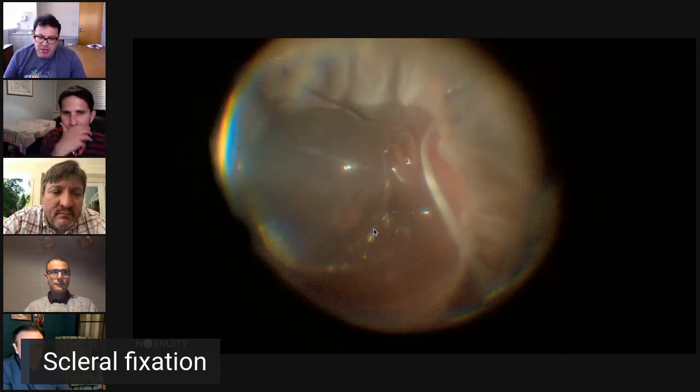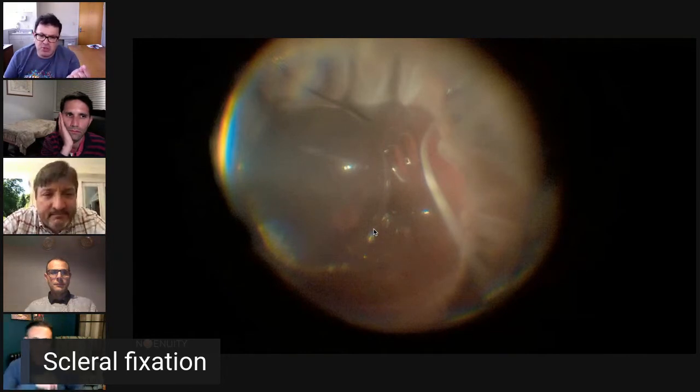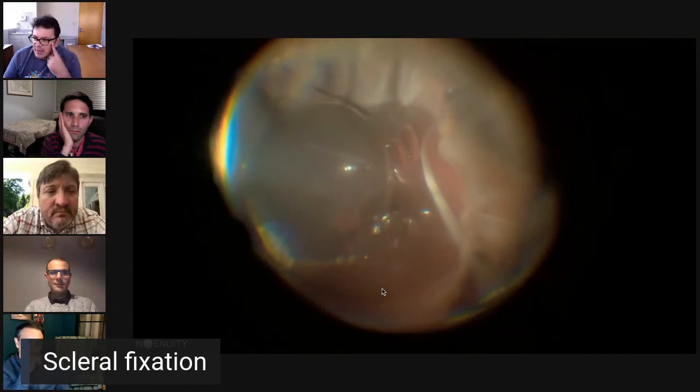Another trick from a colleague of mine here, who has a very nice video on the American Academy of Ophthalmology website, is he uses a flexi loop to hold the suture when using 27-gauge, like to snare it, and that tends to work well as well.